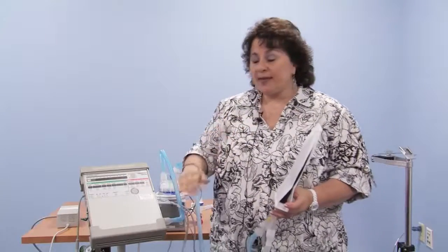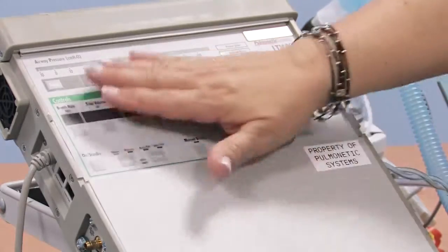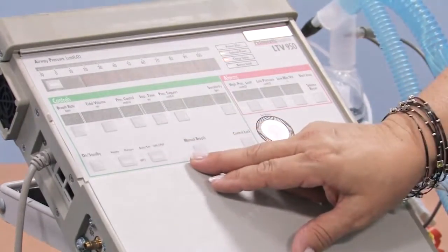Your child may have received BiPAP prior to a tracheostomy tube, so you may be familiar with that, perhaps not. But BiPAP is a term that we use when we're using ventilation with a mask on the face. And when we talk about tracheostomy, we usually call it pressure support, and that's what the ventilator says, pressure support. So depending on the child's prescription, certain values will be lit, and the modes will be ordered.